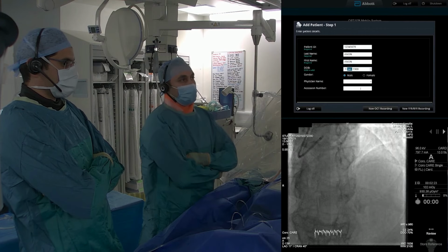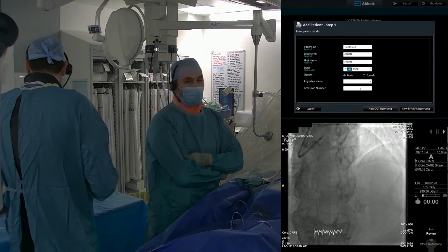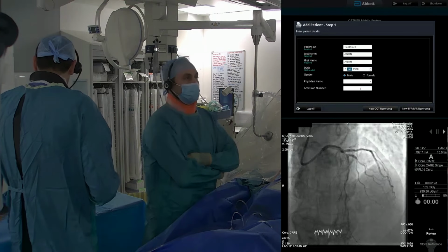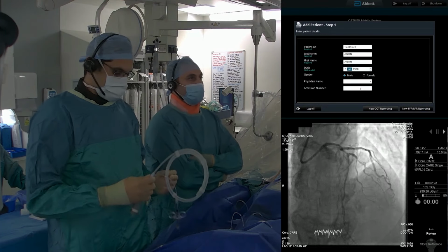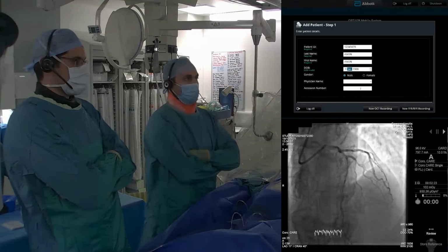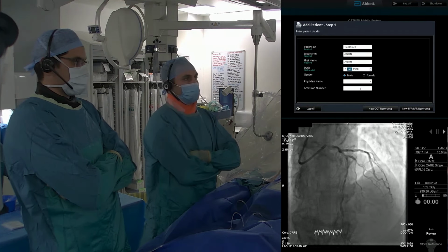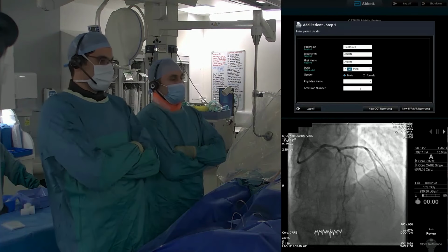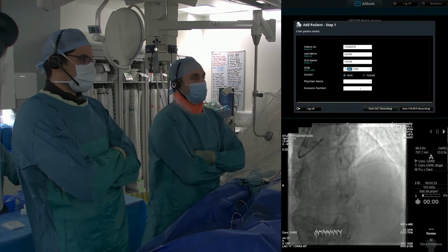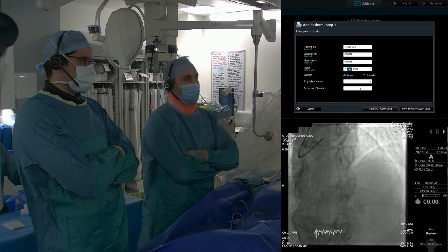In my book, it is mandatory for these cases to do intravascular imaging, whether you do it with optical coherence tomography or intravascular ultrasound. I think it is important to understand the mechanism of the stent failure. In terms of the mechanism, do you want to just talk us through what the mechanisms of in-stent restenosis are? Yeah, there are different ways of categorizing the mechanism, but broadly you could say there's a mechanical and a biological stent failure.